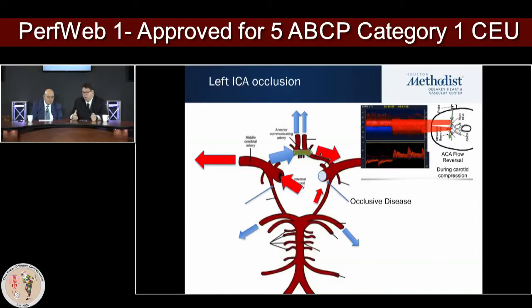Even if you're colorblind, you can probably see that the waveform is switched from negative to positive on the spectrum. The blue signal represented a negative value, while the red signal is a positive value. So you can see it's crossing and changing direction if needed. Those are the flow direction changes that we can quickly see.